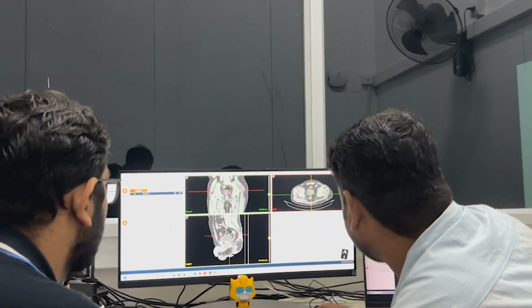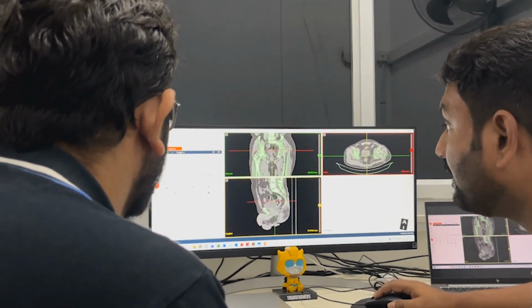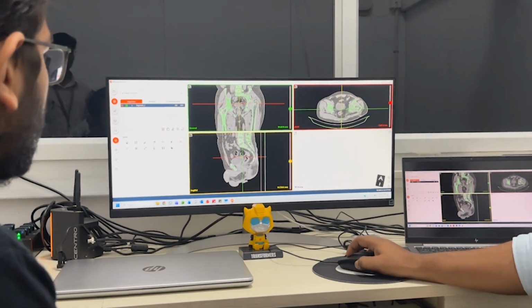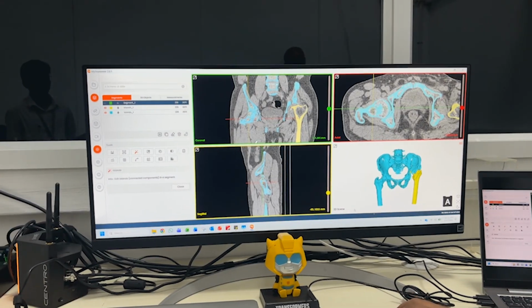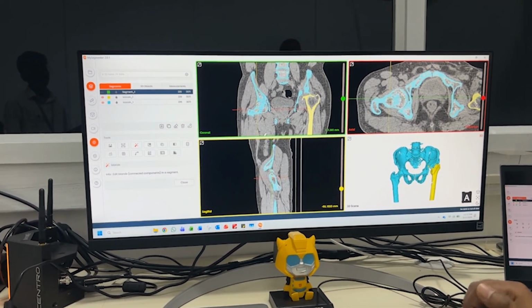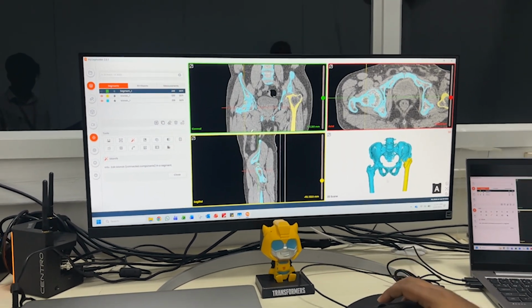So what we basically do is color these bones in green, as you can see. We apply this segmentation, and you can see we have the bone. With that, if you want to work with a particular region of interest, from this we can extract that particular bone and work on designing implants or taking measurements, and for all these purposes.